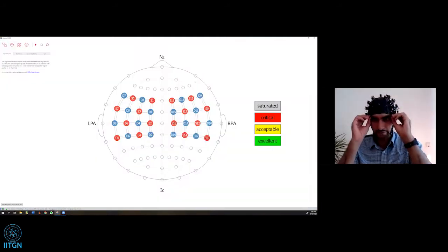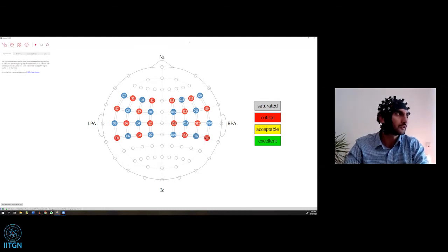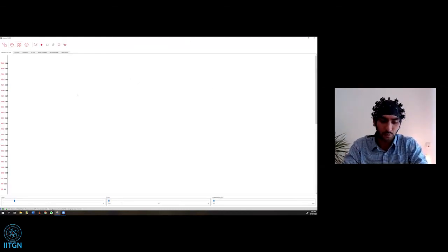The cap I have right now is on the motor region. The one thing about fNIRS is you can record from any part of the brain. It also depends a little bit on the system, but most equipment gives you the flexibility to arrange optodes over your brain region of interest. So you could do prefrontal, and then later in the day you could measure from the motor area, and tomorrow you can do an occipital study.